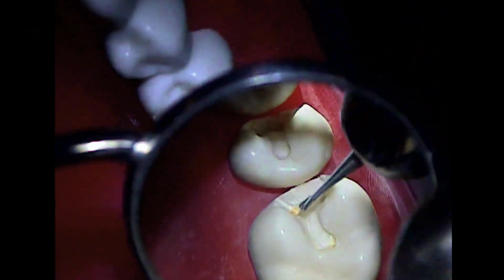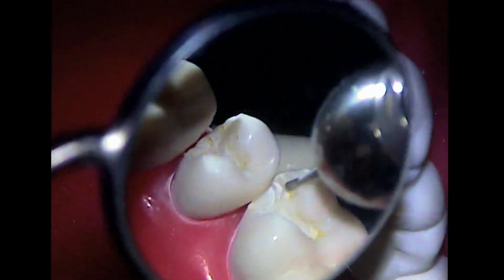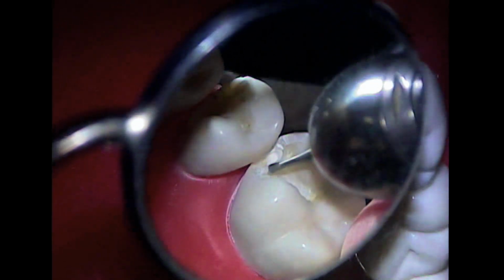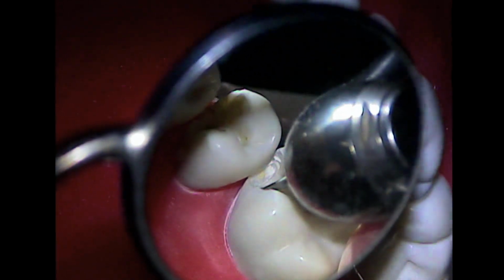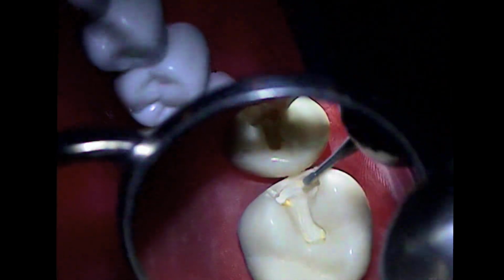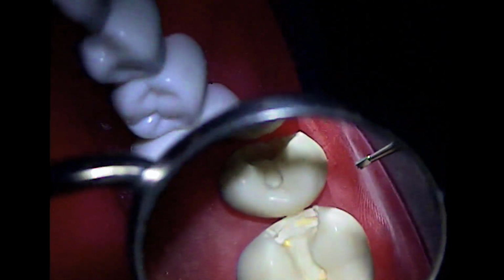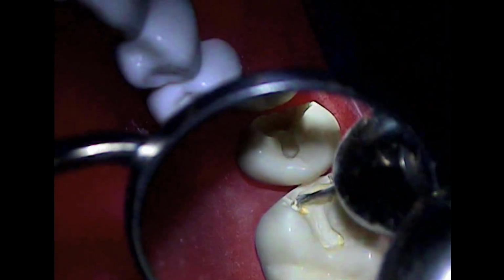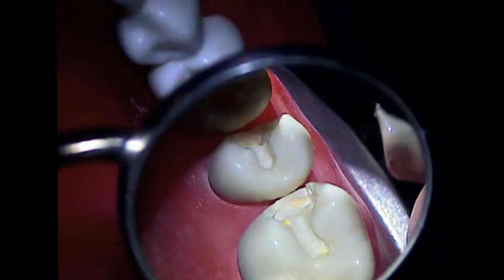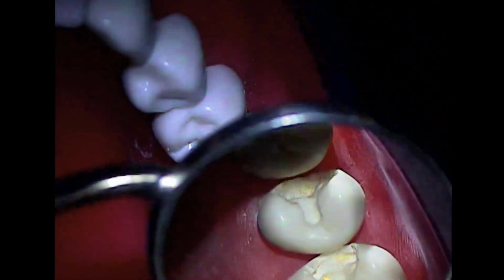When we're happy with the occlusal outline, then we can find the corners of the box. And drill holes where we want those corners to be, and then cut away from those walls. And then all we have to do is get rid of the excess, and we'll have a nice box. So this is a good one to practice with a 55 burr. Get rid of the excess on the lingual, excess on the facial, excess in the middle, and then see if you have any gingival clearance. If you don't, repeat the 7 steps again.